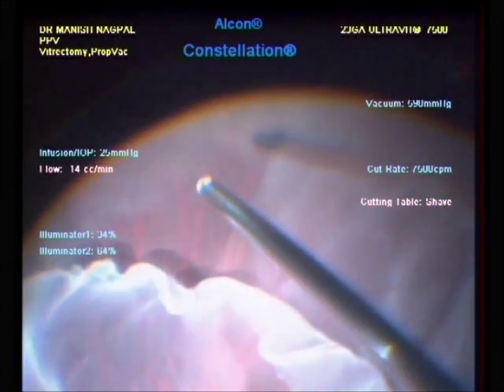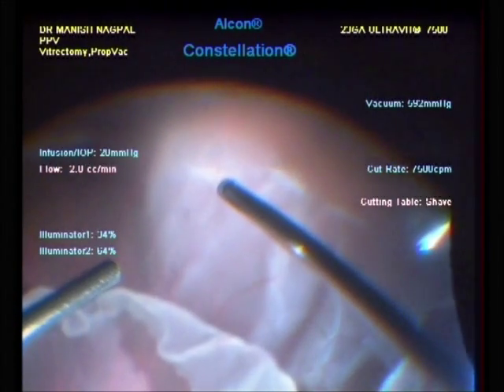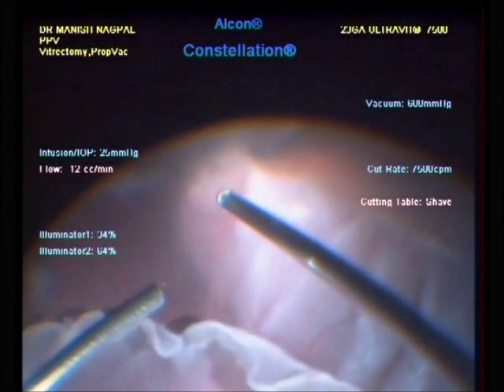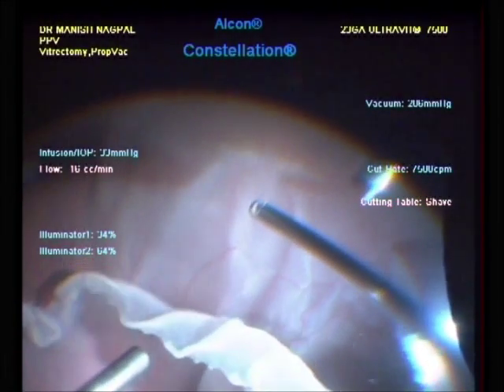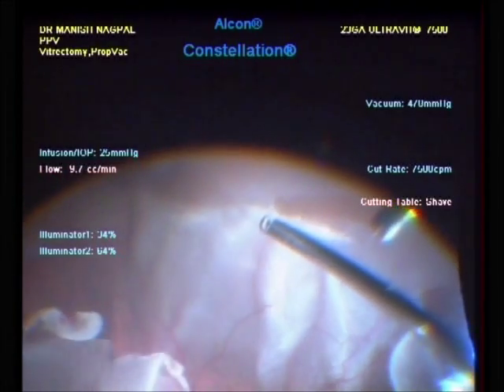After clearing the core vitreous, the duty cycle is changed to shave mode, which means that the port open time of the cutter is relatively shorter, allowing more safety while working close to the retina, especially with mobile retina. Very low turbulence is noted while using this mode.